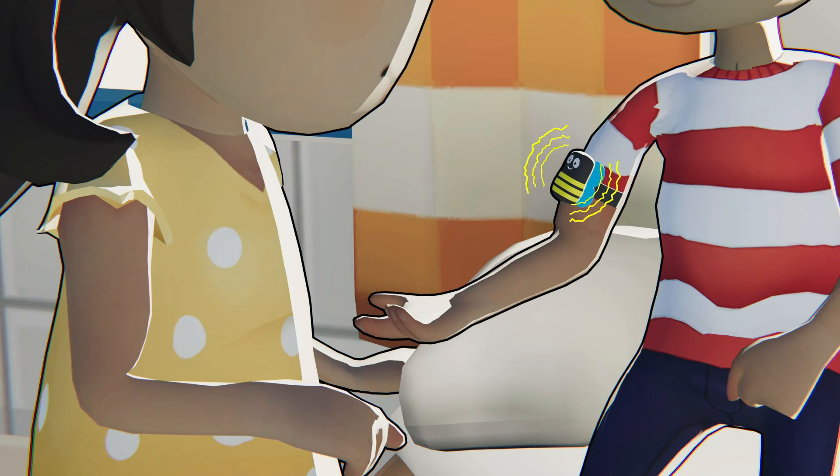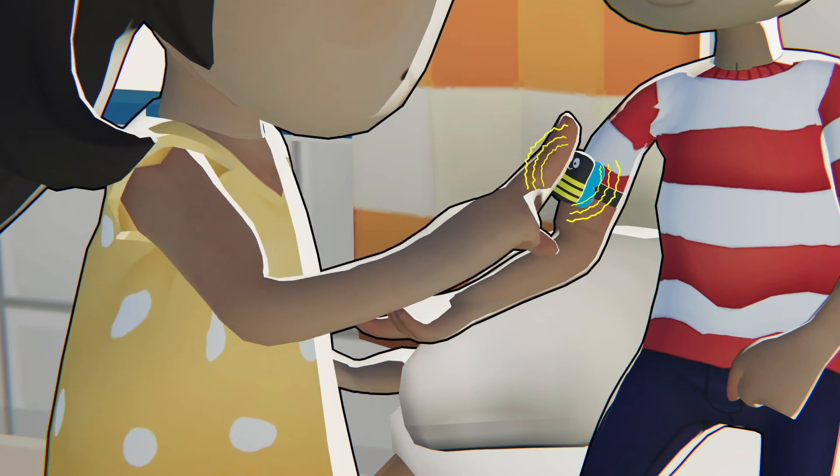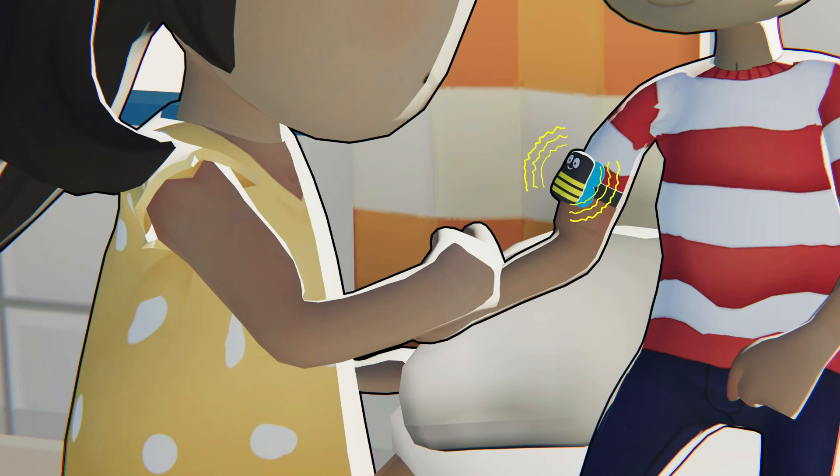You can demonstrate how well the vibration changes the sensation by slightly scratching the skin with Buzzy in place.